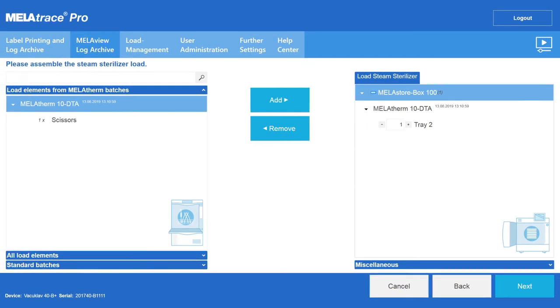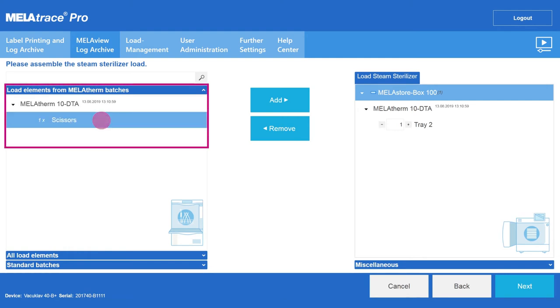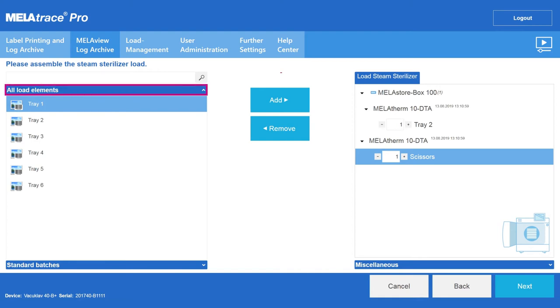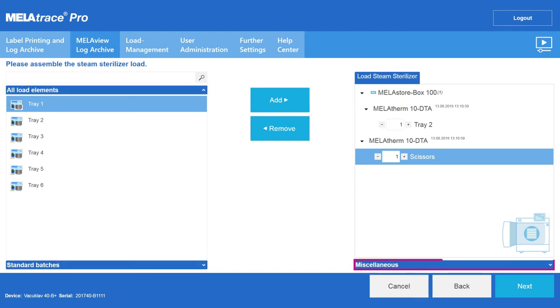The further elements from the washer disinfector batch are wrapped in transparent sterilization packaging and added to the steam sterilizer load. You can also add existing load elements, a standard batch, or new load elements using the miscellaneous tab.